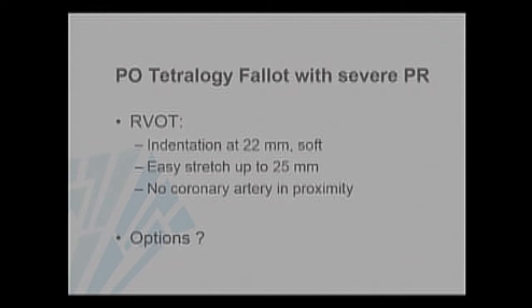So basically the indentation on the balloon was 22 millimeters, easy stretch to 25 millimeters, no coronary artery proximity. So the options are, we can discuss them now. At the current approved valves, the only option, in my opinion, here is the Edwards valve, right? What do you think, Jay and Andrea?